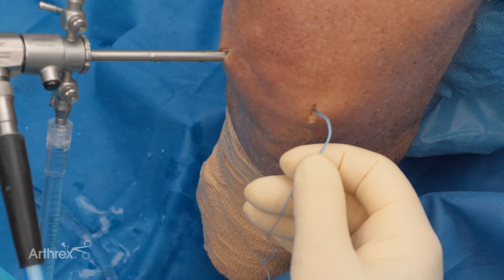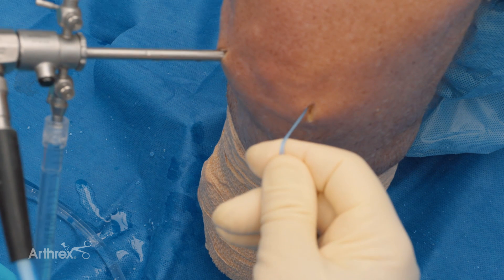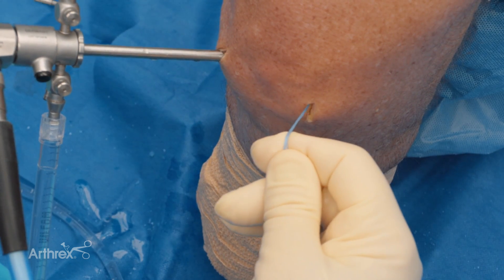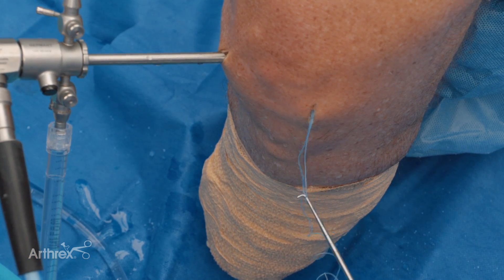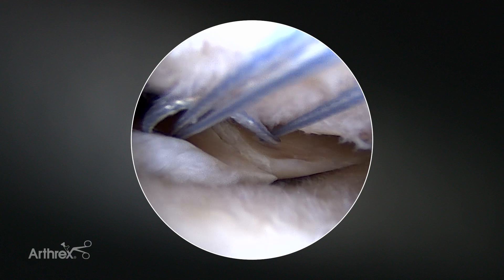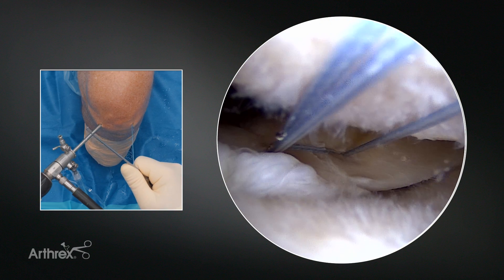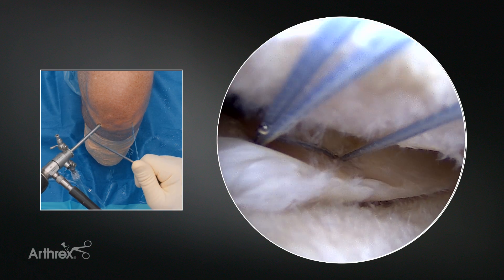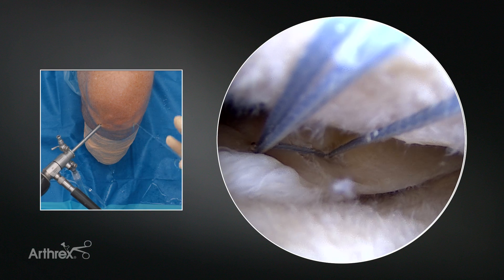Once we have both implanted, we'll sort of grab the suture construct outside and make sure the anchor is set by pulling gently on it. And then with the probe, we'll take the loop and tension it down. I'm going and trying to judge the tension I want to get as I go. Once I'm there, I'll grab the long suture and pull in the second piece.